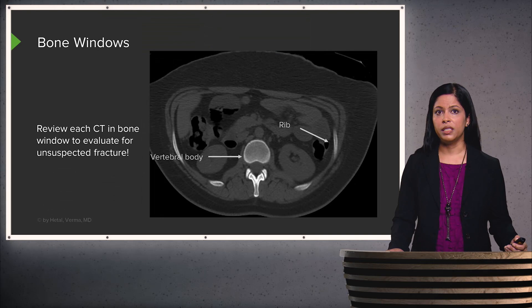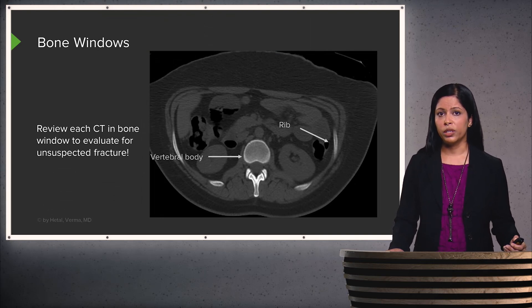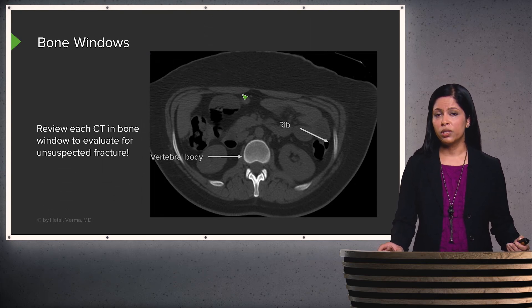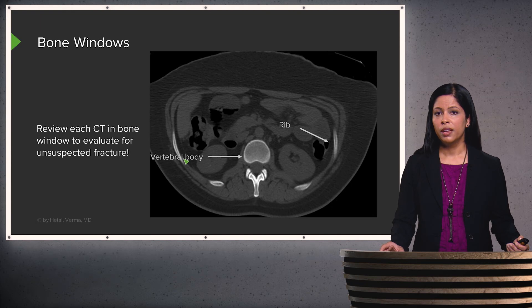Next, I take a look at the CT scan in bone windows and evaluate all of the different bony structures. Here you can see multiple ribs, the vertebral body, and the spinous process of the vertebral body.